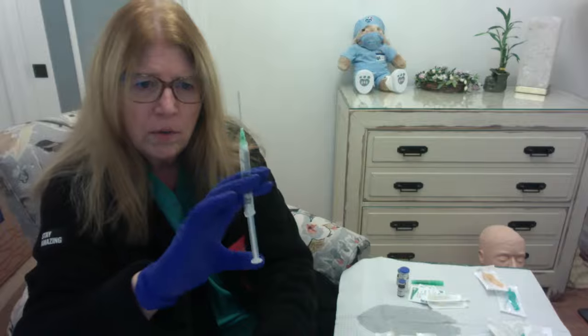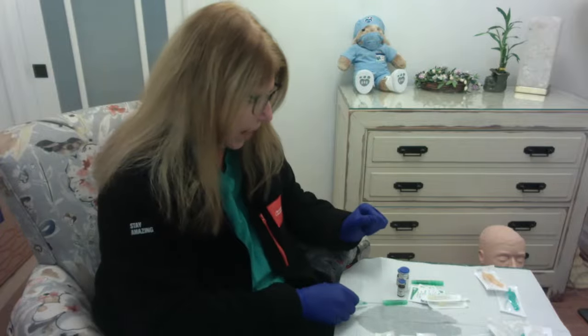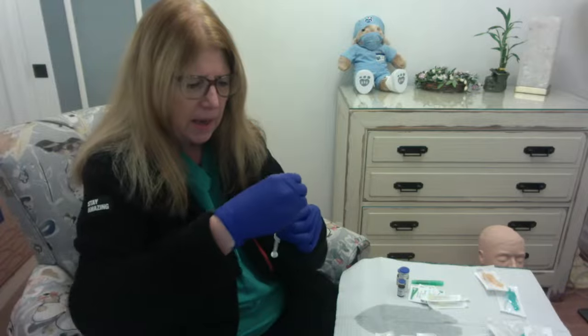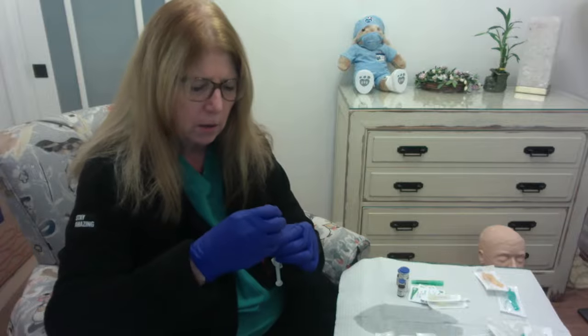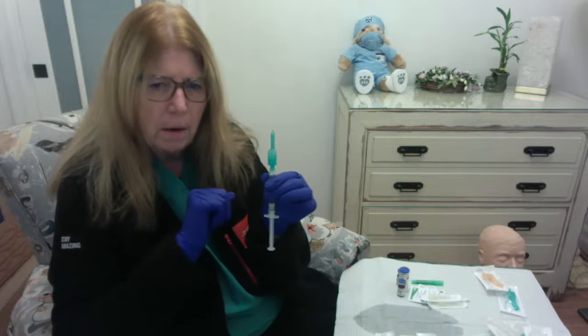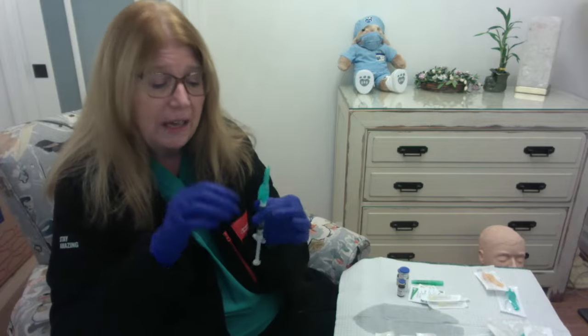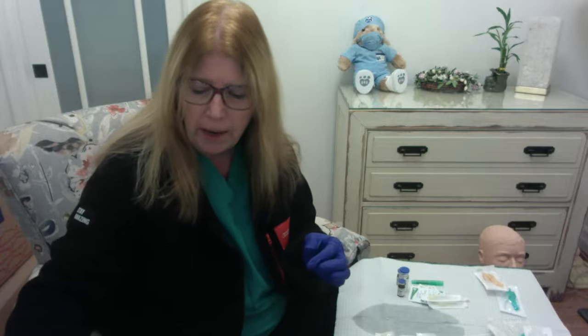We have all of the medication in there. I safely put my cap back on one-handed, and then I'm going to make that needle change, right, to get rid of that filter needle to make sure that I don't inject any of those glass pieces into my patient, okay? All right, so that's our ampules.